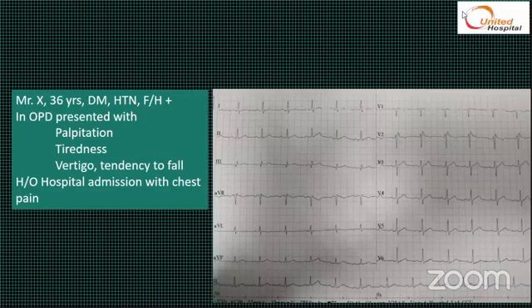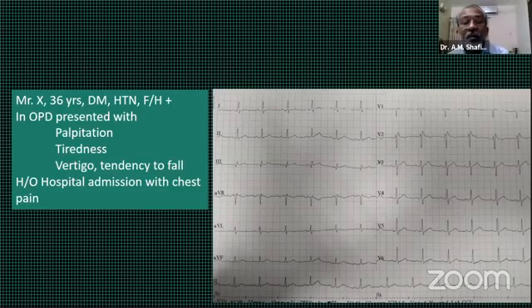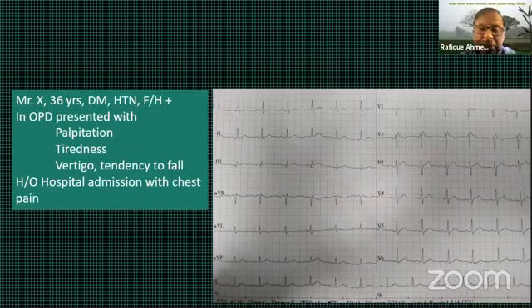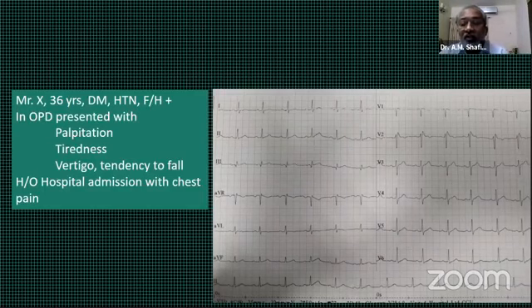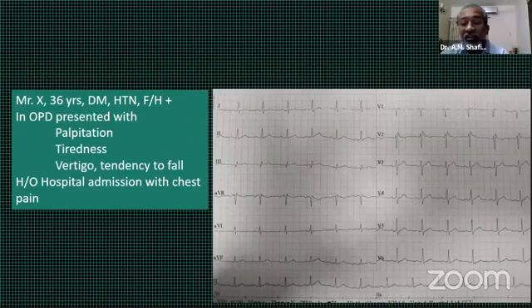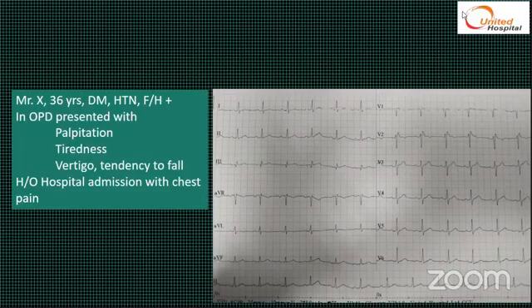Sir, if we look at lead V2, right bundle branch block may be a possibility, sir. If you see V1, is there any right bundle branch block like ECG? No, sir, V1 does not give any picture like that. Okay, that's a good point. Here V2 has RBBB-like features. And T wave inversion, right? Actually, in V2 there is a T wave inversion as well. Right, sir. Okay.